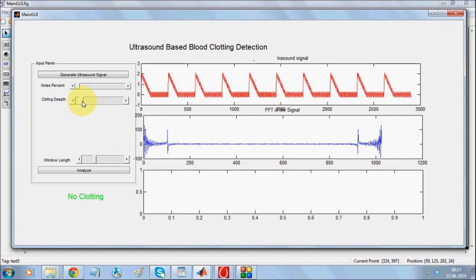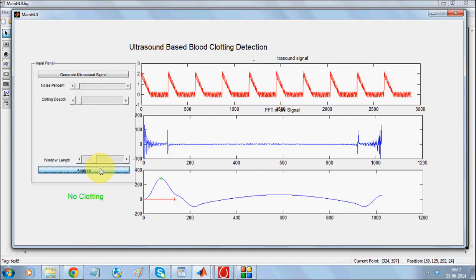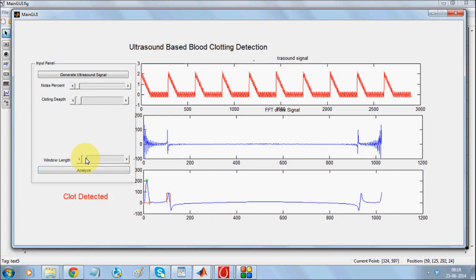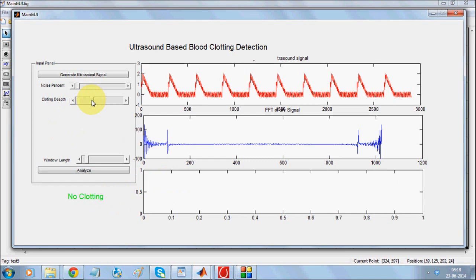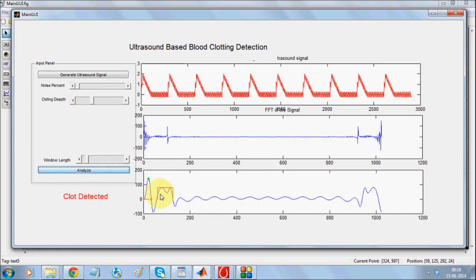Now, if you analyze the signal and keep it at a certain value, this is the ideal value — it shows no clotting. If you increase the clotting depth and analyze, it correctly detects that there is a clotting.